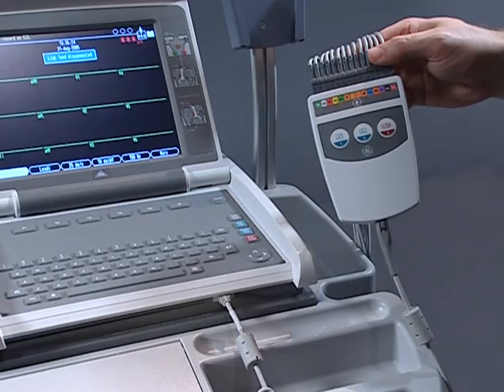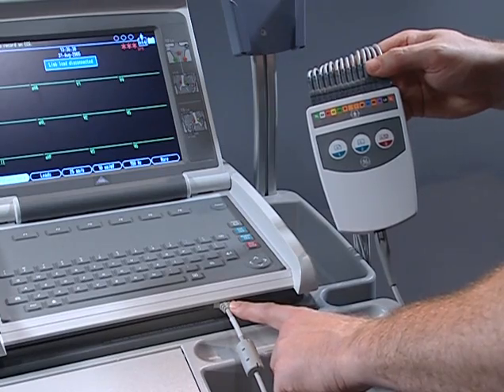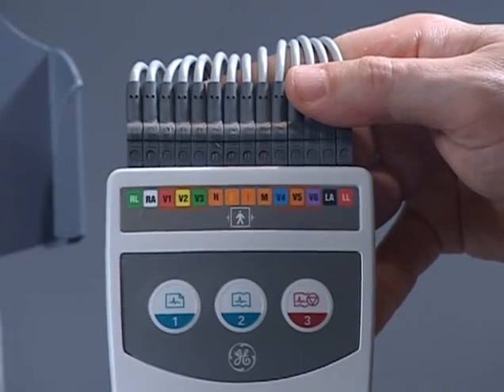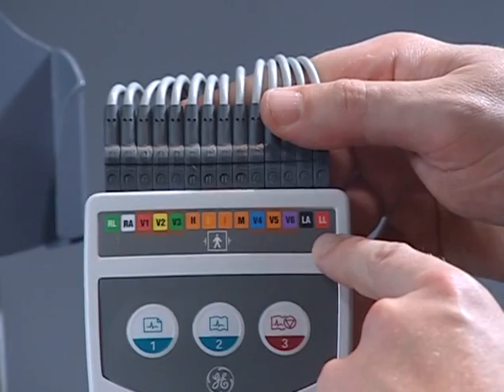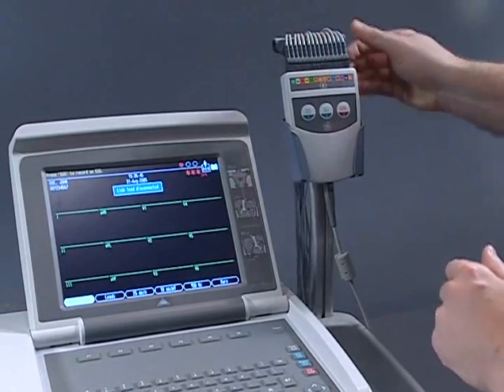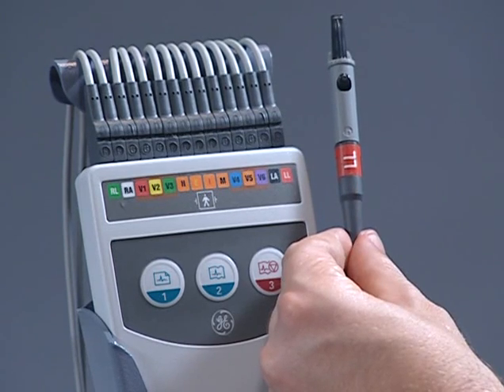This is the acquisition module. One end of the cable fits into the internal connection on the front of the MAC 5500. The other end fits securely into the acquisition module. The lead labels on the acquisition module identify where each individual lead wire should be connected. You can identify each lead wire by looking at the clip connection for the wire label. Each lead wire connects to its corresponding labeled slot in the acquisition module.